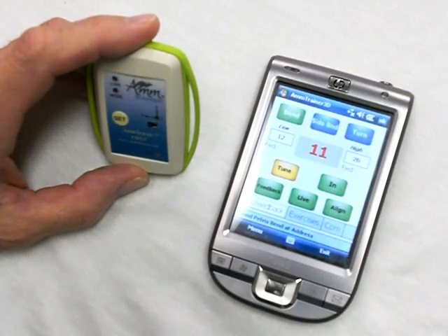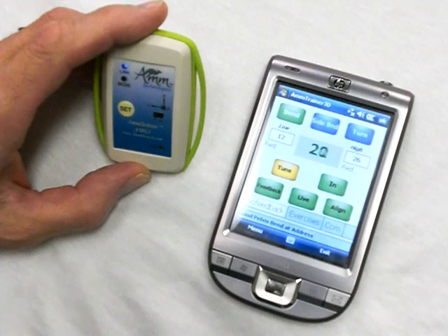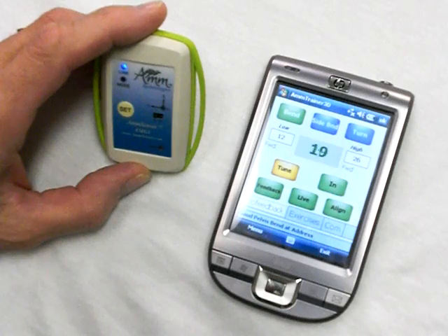Go back to biofeedback mode. Now when I get into the good zone — in other words, when I have the appropriate amount of pelvis forward bend — the number on the screen goes green and you can hear a nice tone telling you that you're in the correct position.